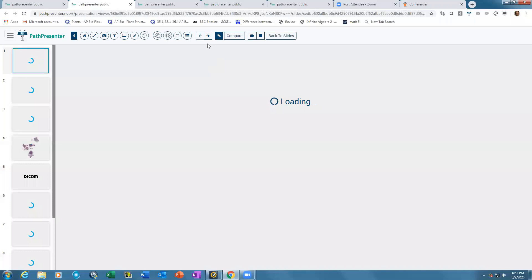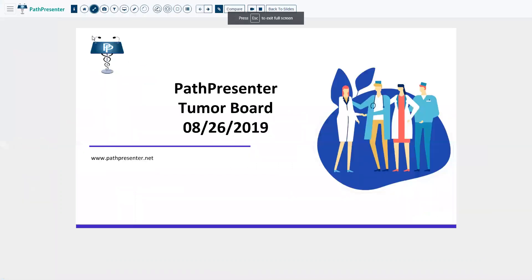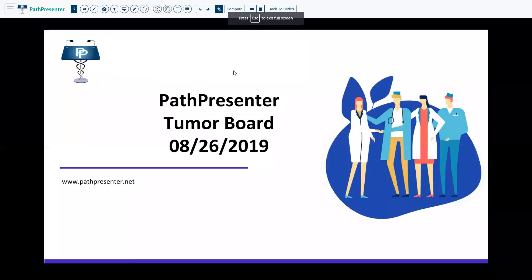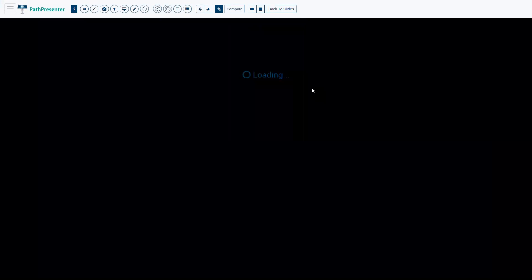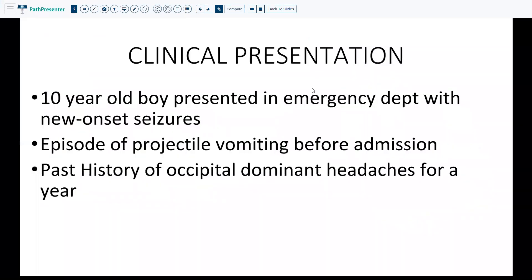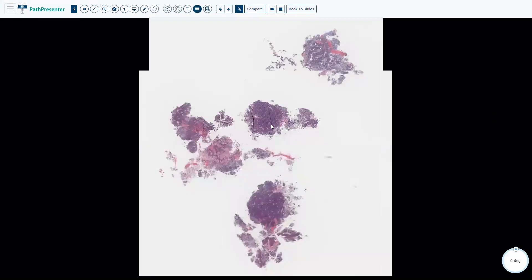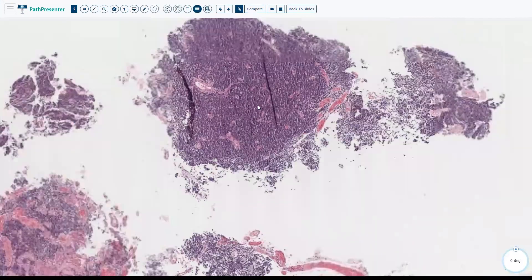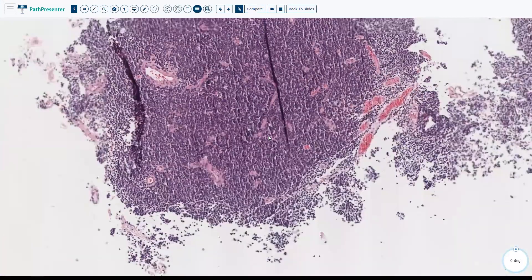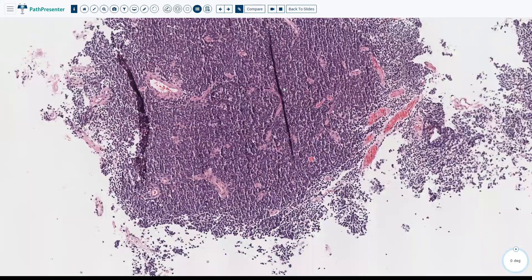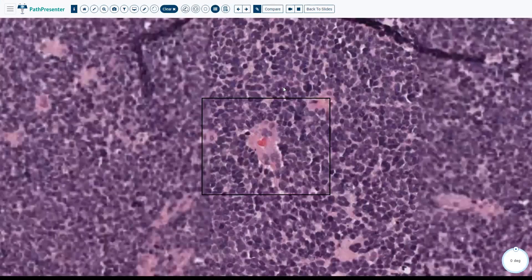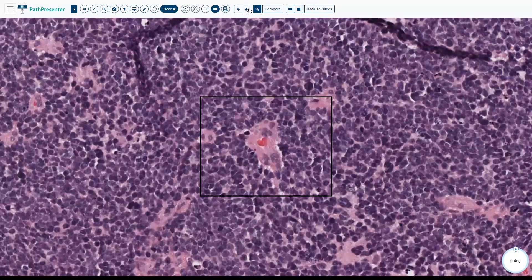This opens PowerPoint slides, radiology images, and DICOM images in one seamless presentation. Use the full screen button and right key on your keyboard to move from slide to the next. This is seamless integration of digital slides - you can zoom in and annotate. Click the down key to move from one annotation to the next and the right key to move between slides.